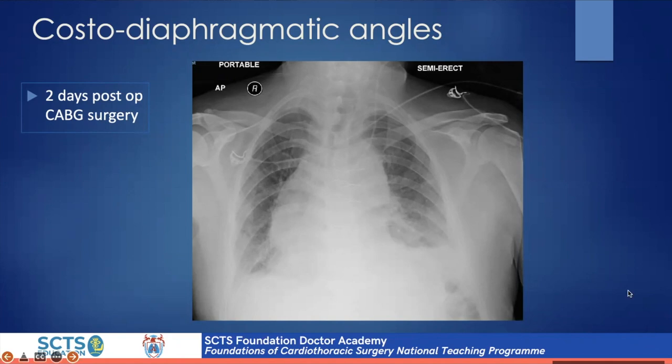Hi. So starting with the airway, seems all sort of central. The trachea seems sort of central. So in terms of costodiaphragmatic angles in the left side, I couldn't pick the costodiaphragmatic angle. And I assume that there are some fluids which makes radio opaque in the lower part of the left. Apart from that, I can choose four sternotomy stitches that I can see in the midline. And in terms of the costodiaphragmatic angle on the right side, I could choose the angle, so I cannot say that it's full of fluids or something like that.